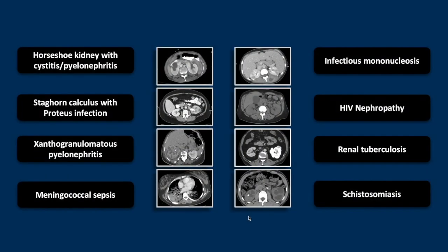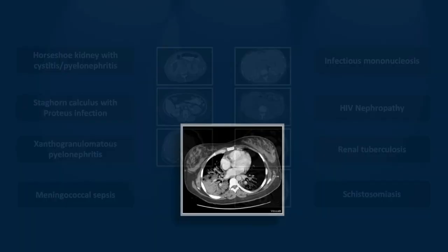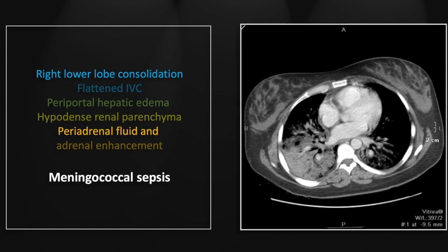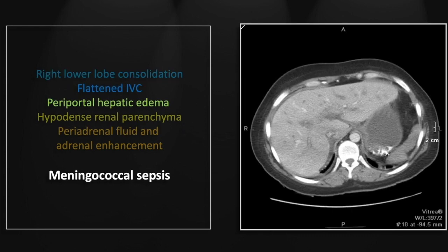Our next case is of meningococcal sepsis — a highly unusual case that fortunately was called correctly by our radiologist in real time. There is blatant right lower lobe consolidation consistent with a severe pneumonia. Lower down there is thinning and flattening of the IVC consistent with profound hypotension.